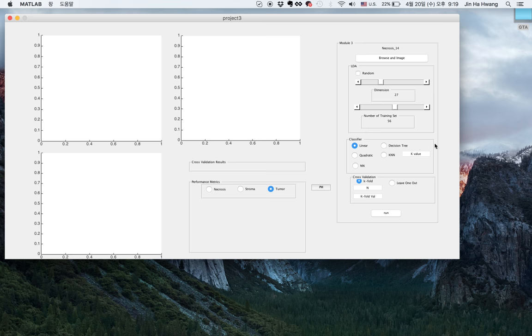Here is the classifier. We have linear, quadratic, neural network, decision tree, and KNN. This here is the cross-validation matrix. We have k-fold and leave-one-out.